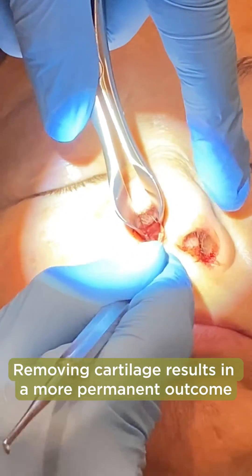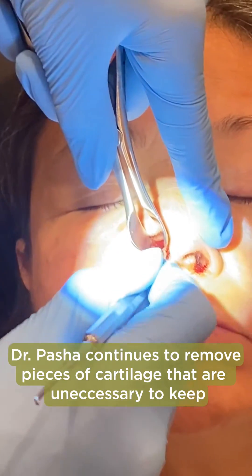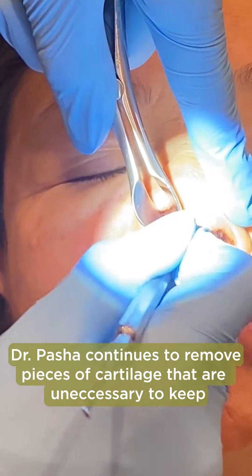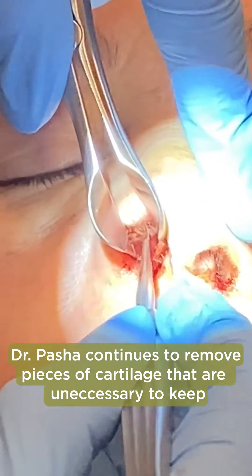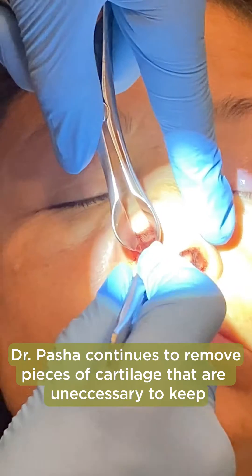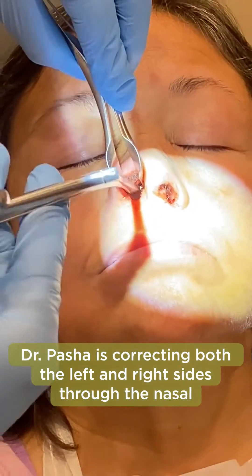That's a crunchy sound — we expect that. Go ahead and move that cartilage over. That crunchy sound is music to my ears. Now I'm going to take a strip off this cartilage and maybe a little bit of the septal bone, and then I'm going to go ahead and remove it.